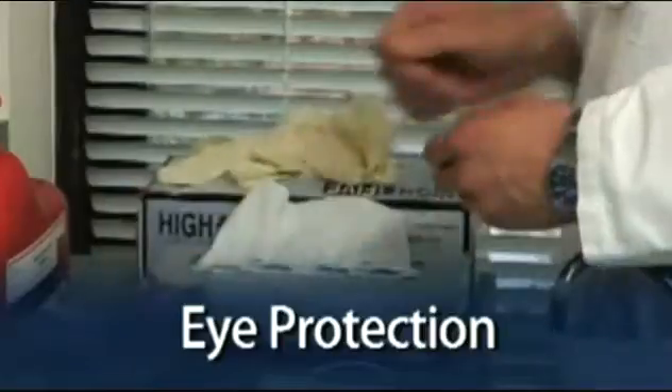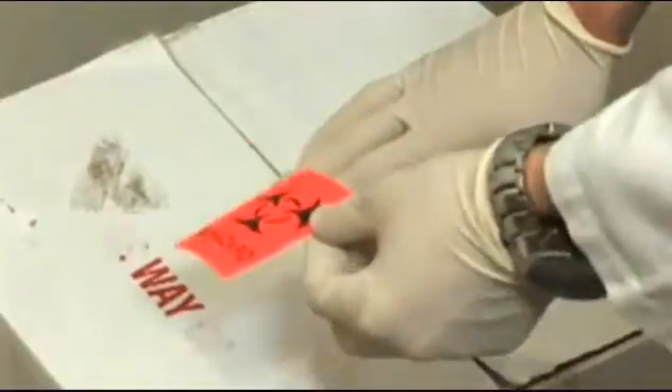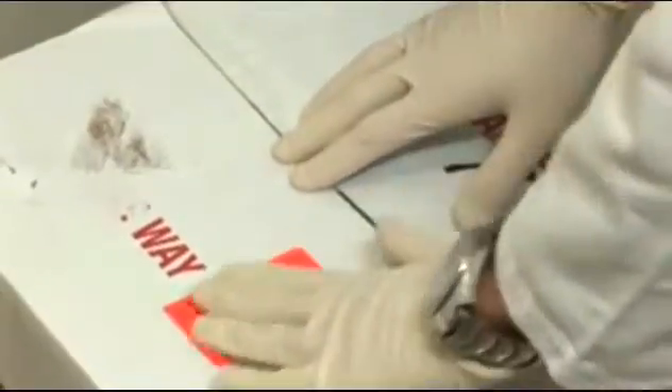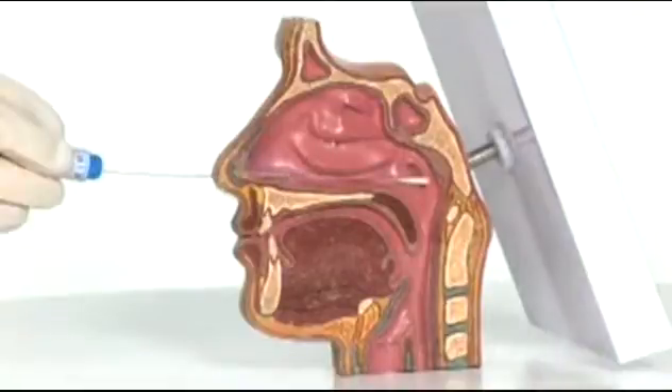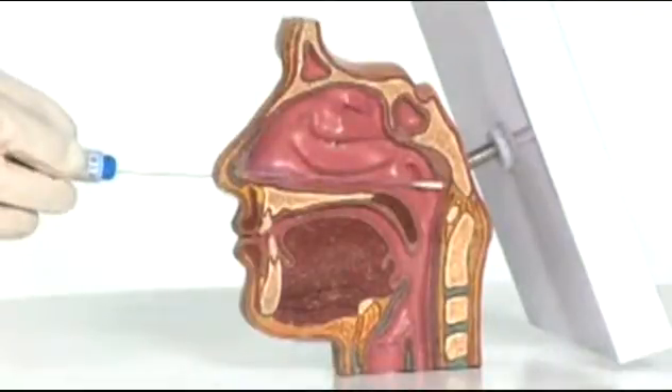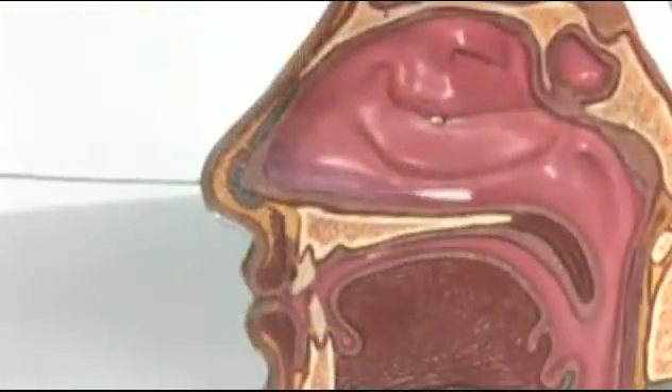You will also need a shipping container with cold packs and a biohazard label. Swab specimens should be obtained from the posterior nasopharynx. Throat swabs and anterior nasal swabs have unacceptably low rates of recovery, and these specimen samples should never be collected for Pertussis diagnosis.